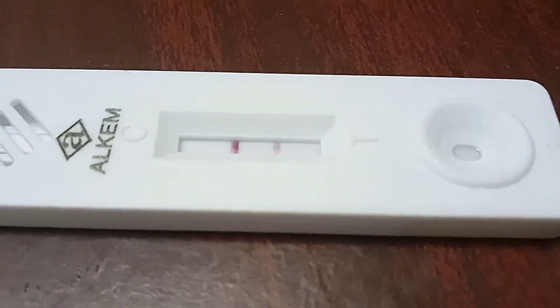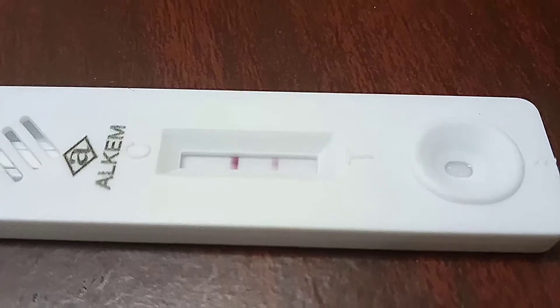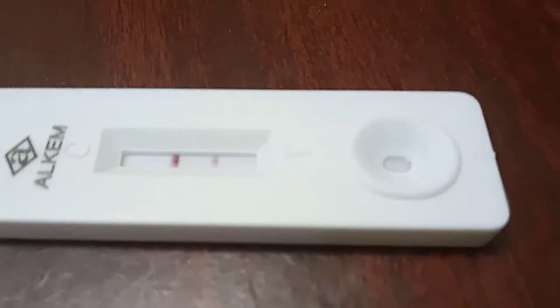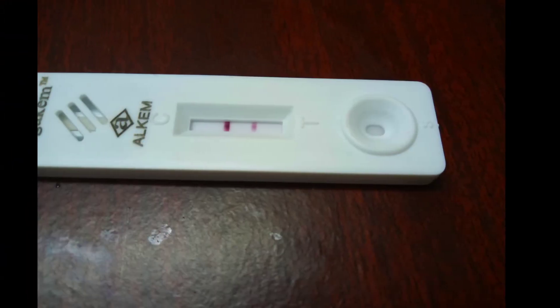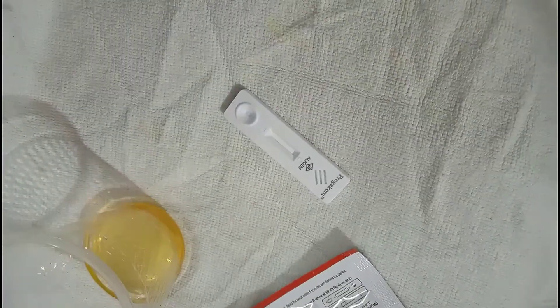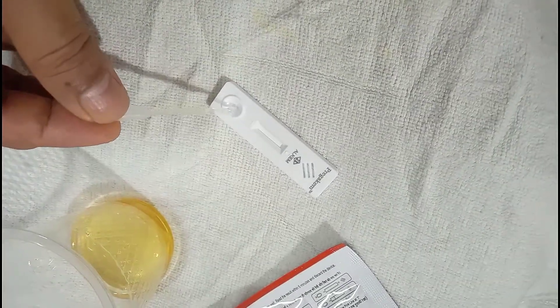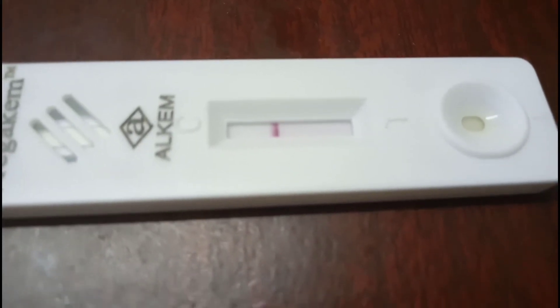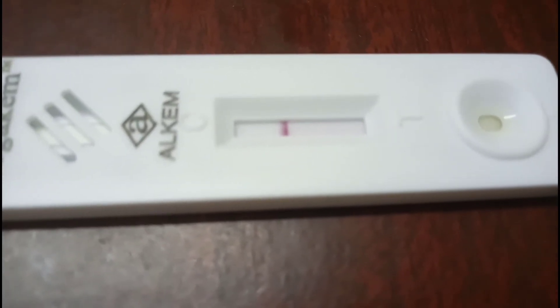Both lines are colored, so the test is positive — it means the woman is pregnant. Now I will test another woman's sample, and I found that this test is negative, so that woman is not pregnant.